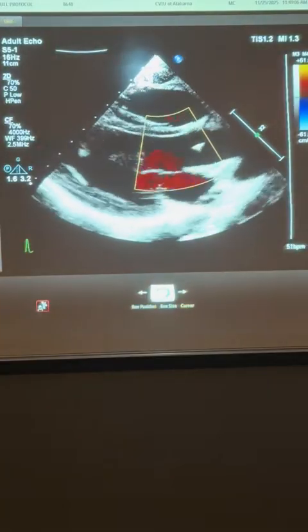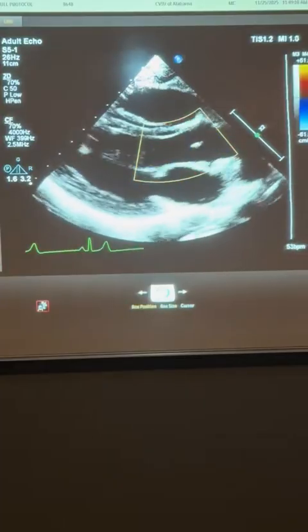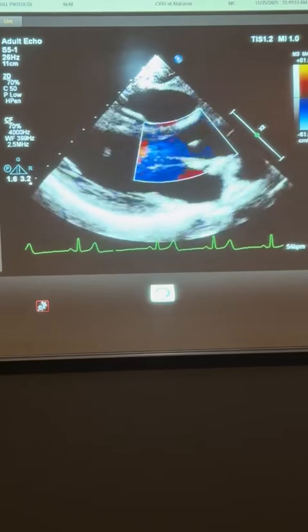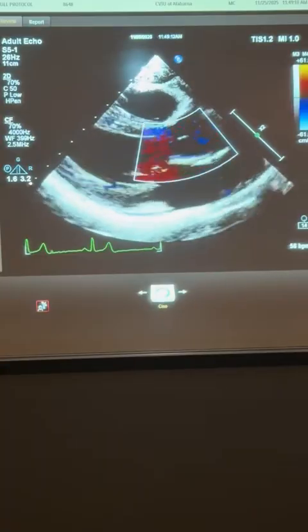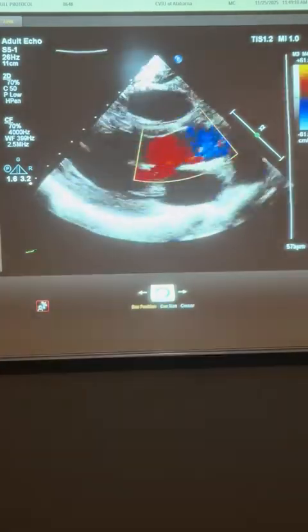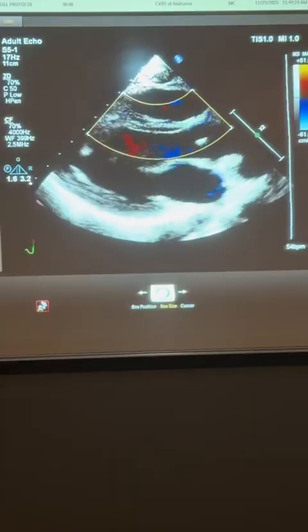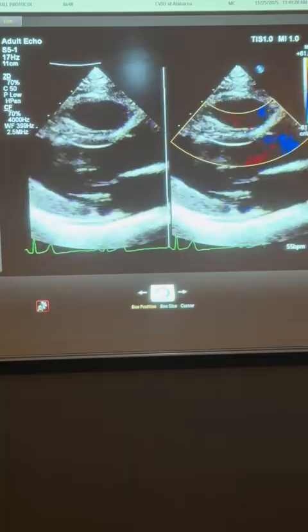And I'm going to bring the box up, widen it just a little bit to look for aortic regurg or potentially stenosis turbulence. And we're going to go to our intraventricular septum. I wanted the entire length of the septum. And then I'm going to hit color compare.